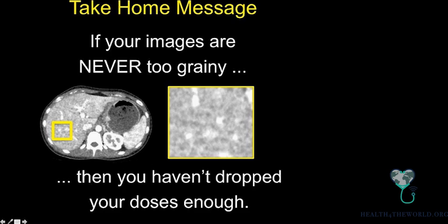Don't be afraid of seeing this. If, with one patient, yes, it causes some confusion, and then you react to it, perhaps that's better than being so slow and so incremental in your dose reduction that you never actually make it to this point.